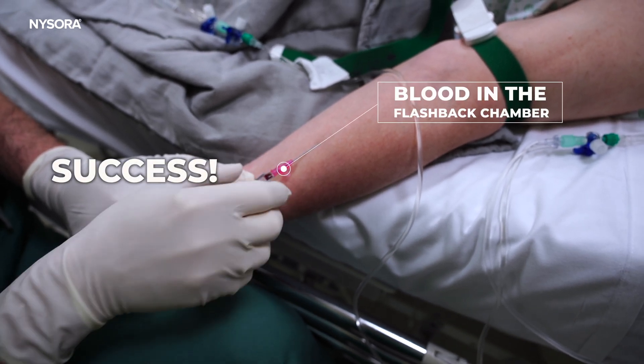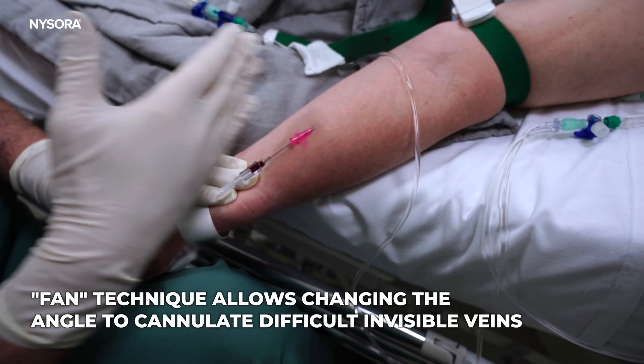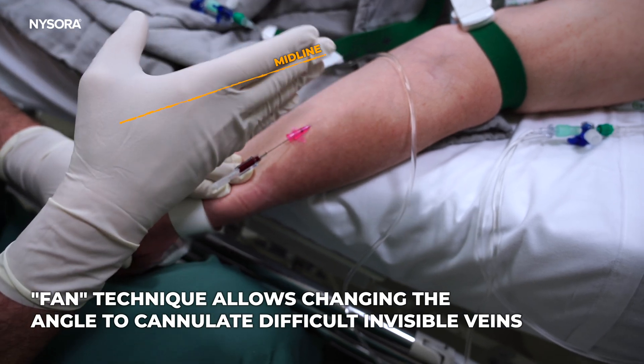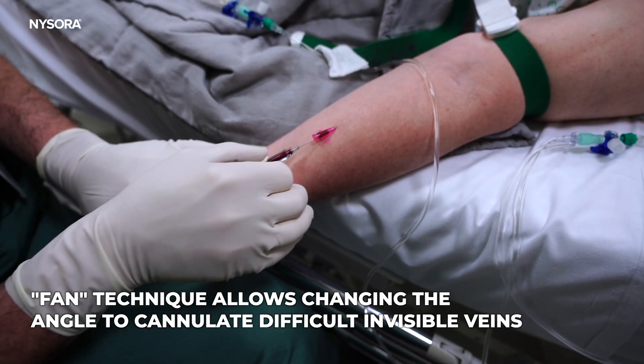And now it appears to be in the vein. You see, a little fan technique that allows us to go left, right, or midline — left, right — results in cannulation of a deeper vein.